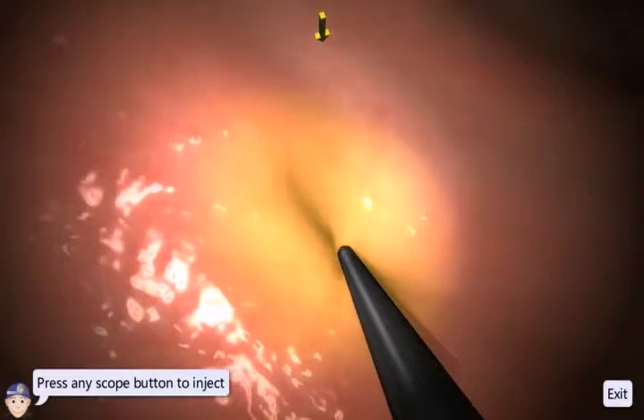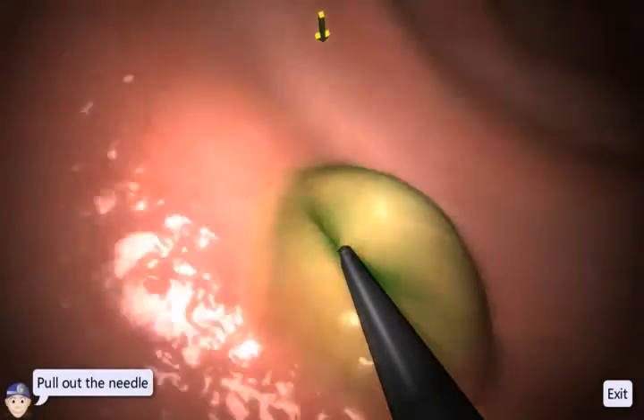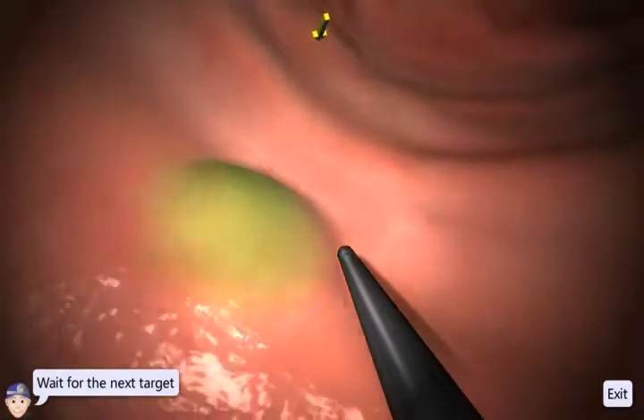Be sure to inject as close to the center of the highlighted area as possible for optimal results.